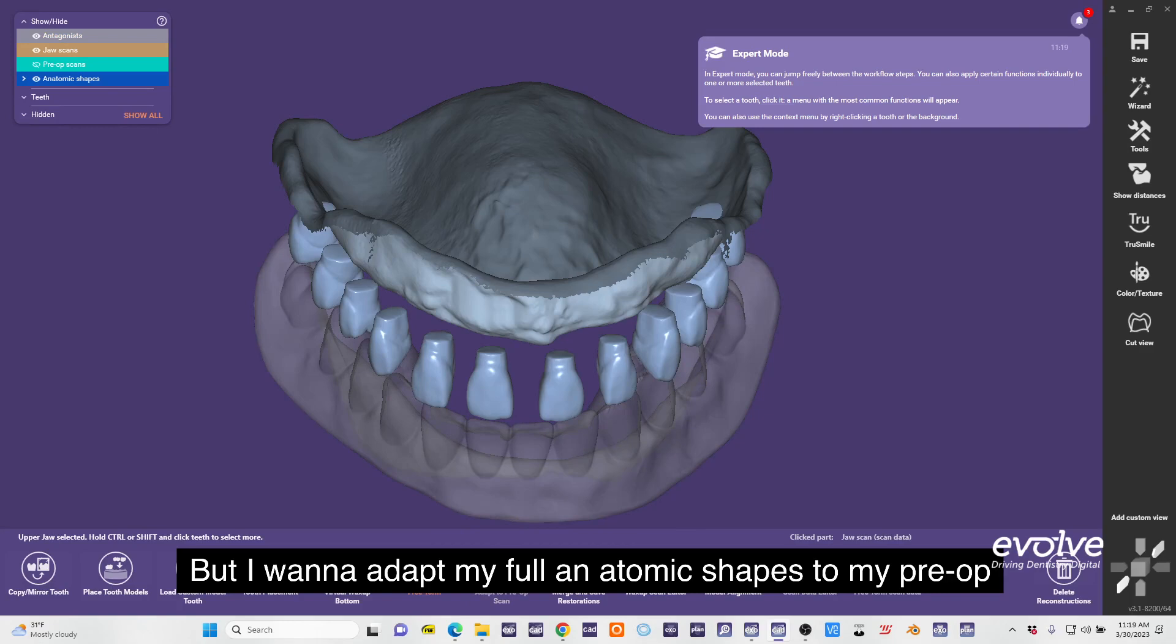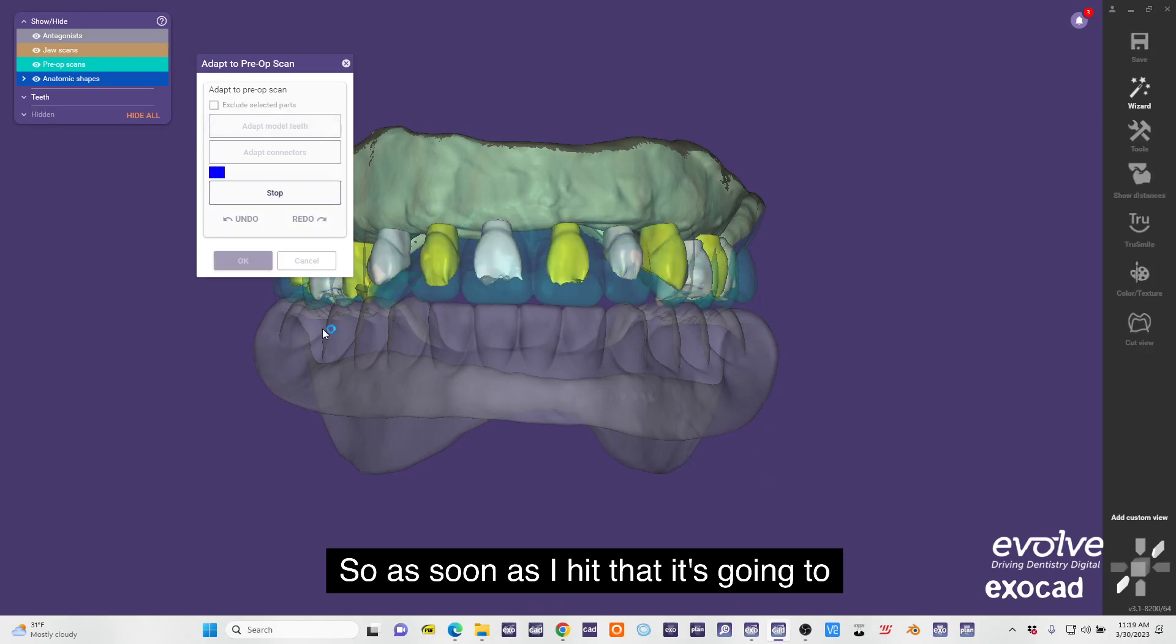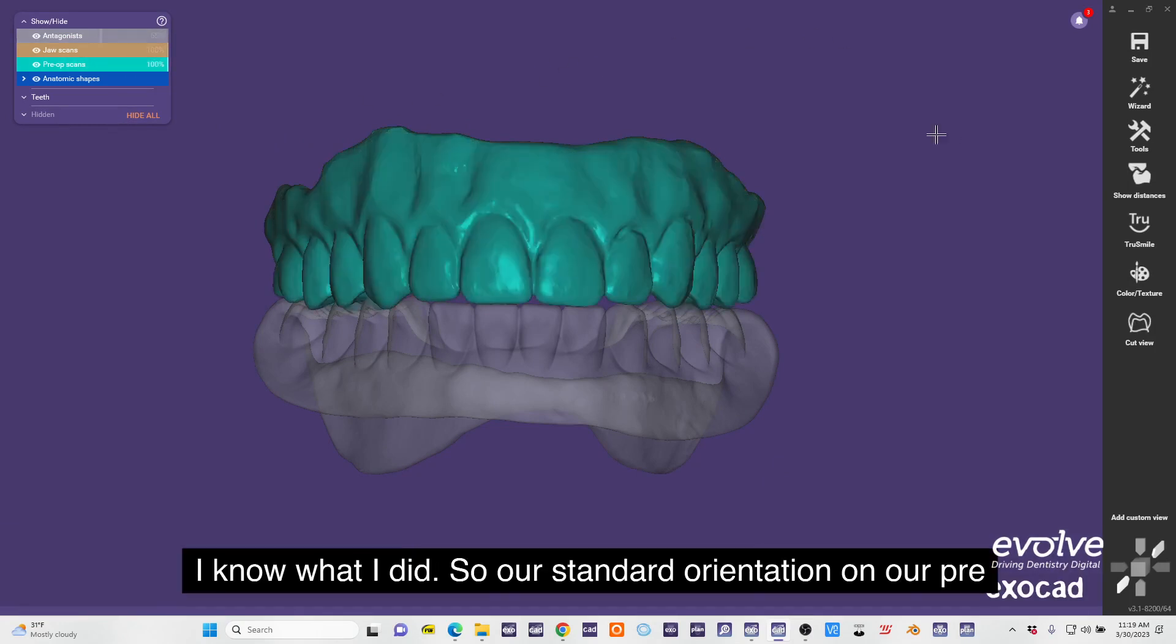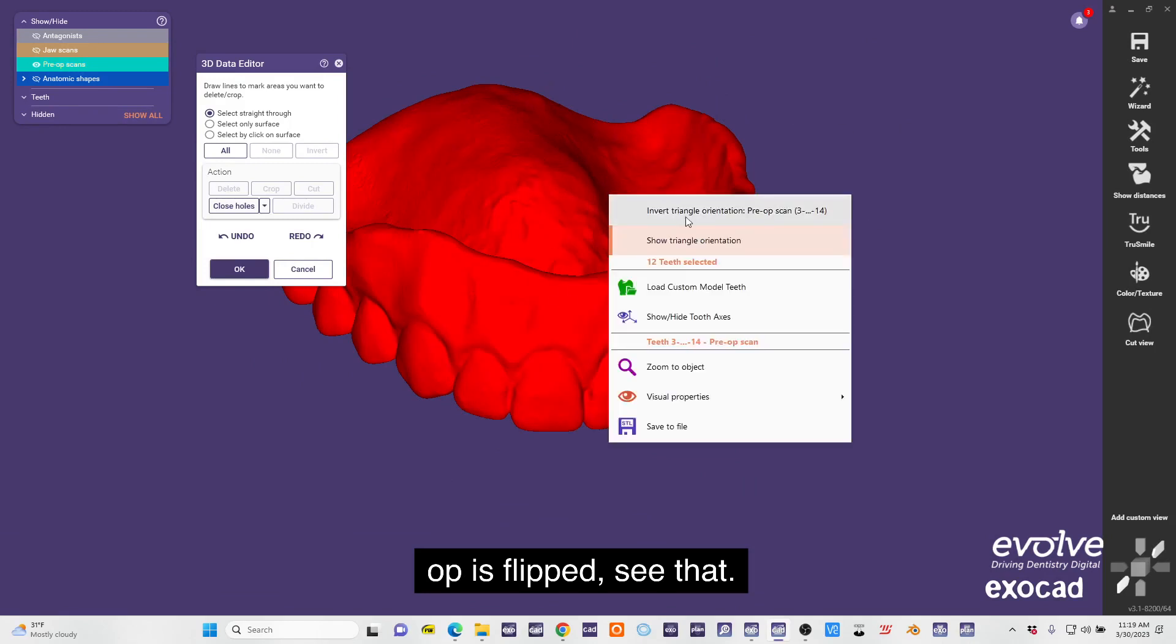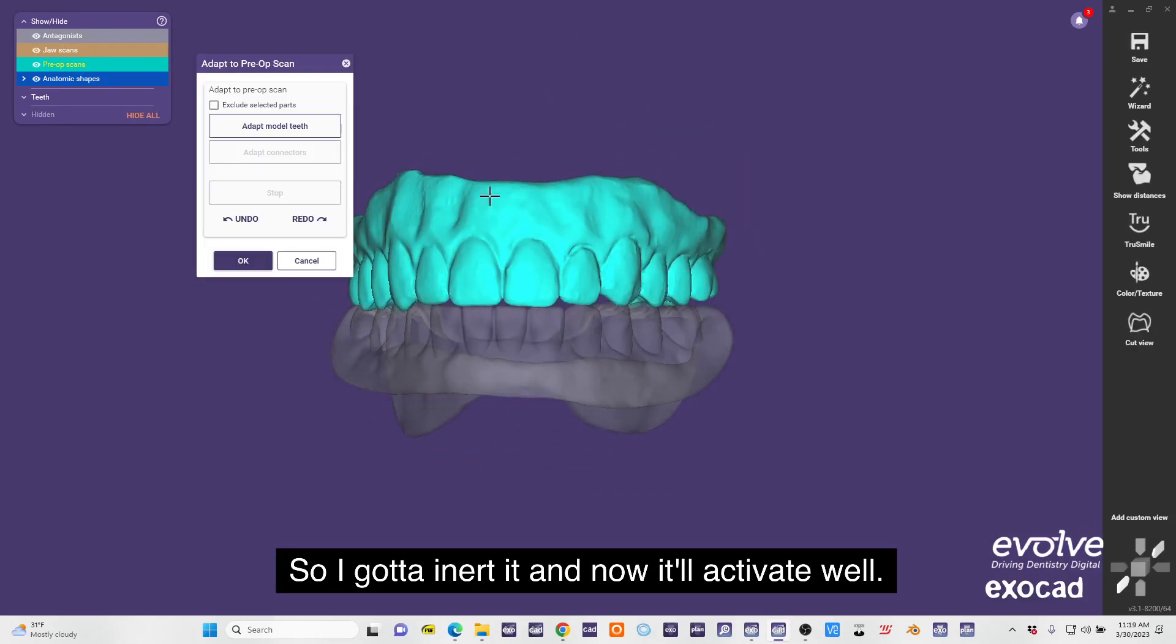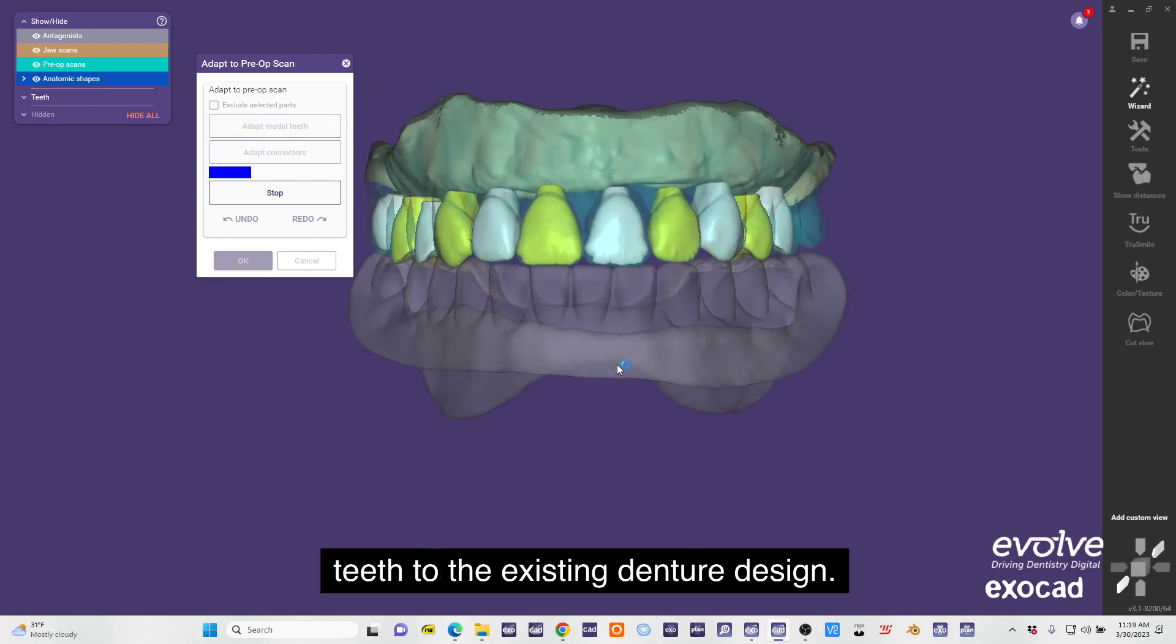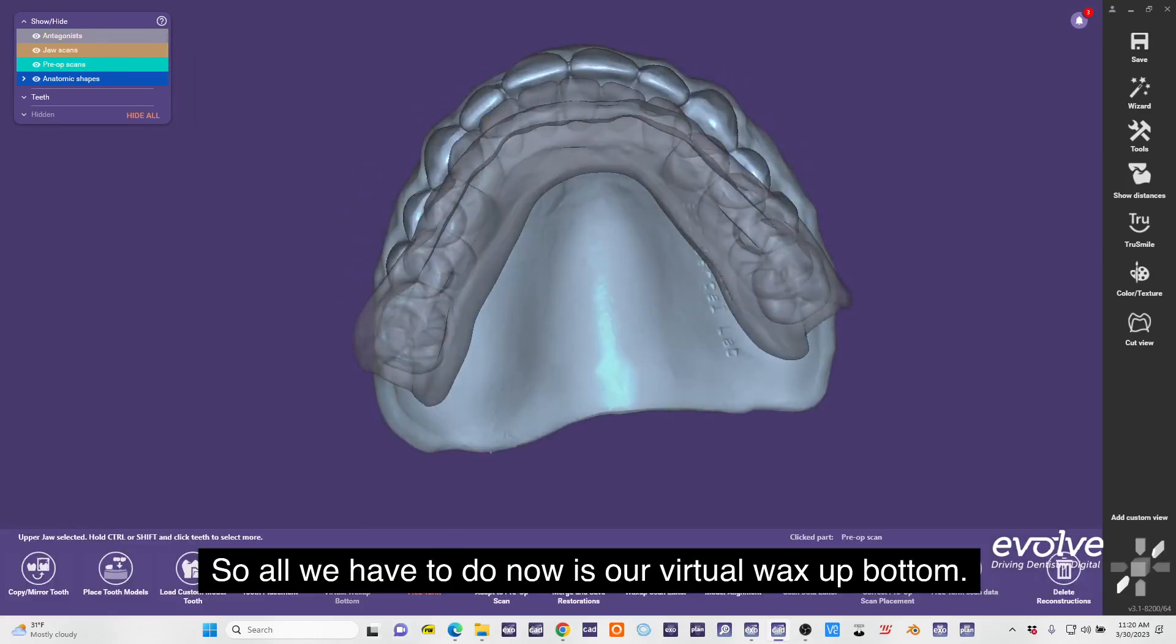And that's what I'm going to do right here. So as soon as I hit that, I messed something up. I know what I did - our scan data orientation on our pre-op is flipped, see that? So I gotta invert it and now it'll activate. Adapt model teeth and now it's adapting our CAD teeth to the existing denture design, perfect.